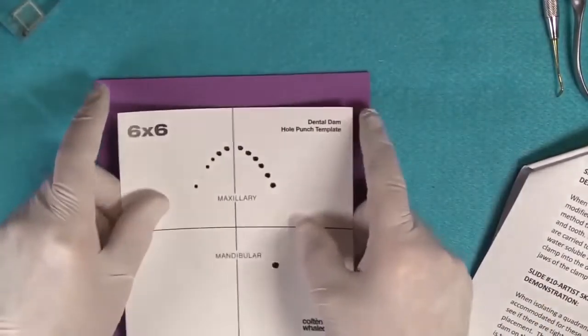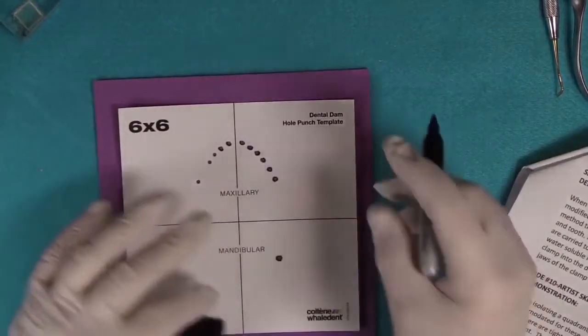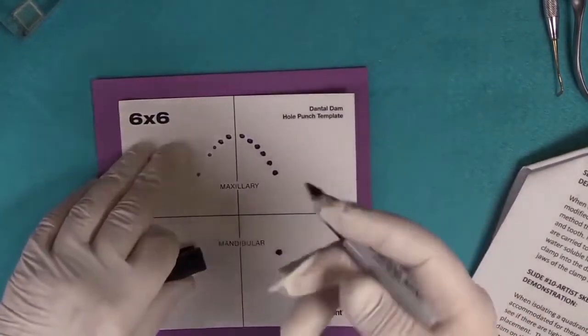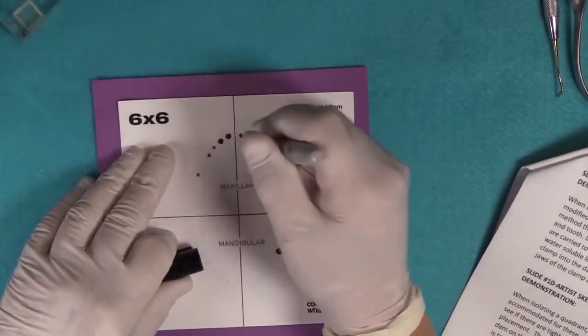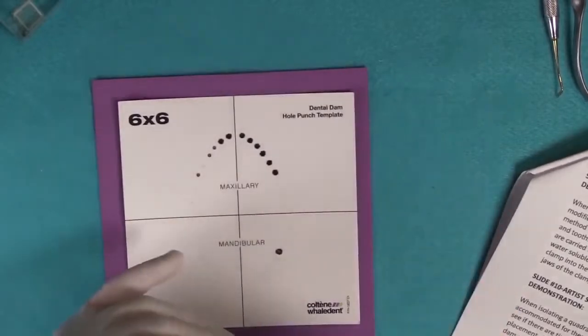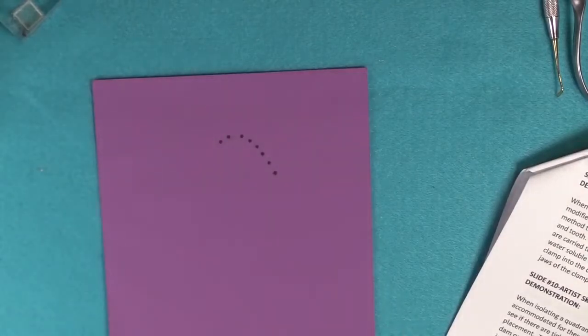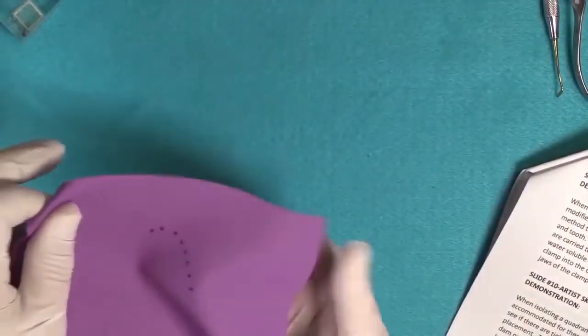Now, as I mentioned, you can go ahead and mark your dental dam if you'd like. I know where I'm going to put my holes, but for those of you who may not be so adept at doing this, we're just going to mark our dental dam like that for the upper arch. And as I said, it's easier if you put the dam on the frame and then punch your holes.